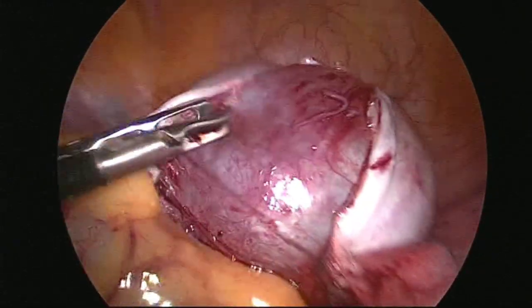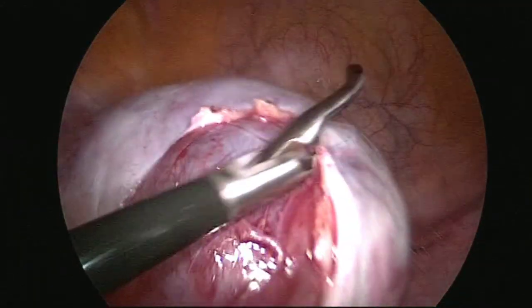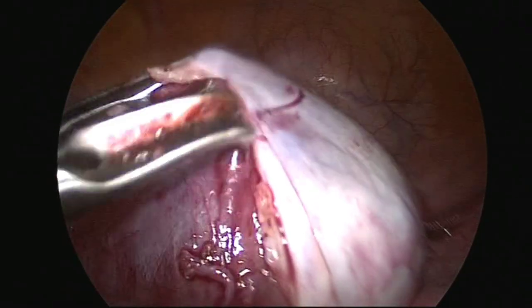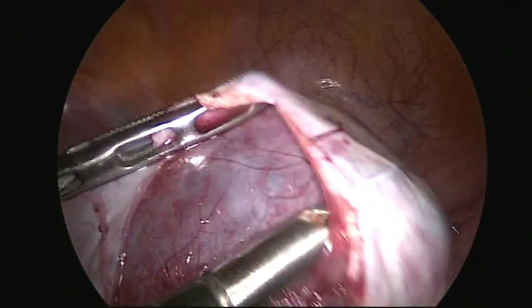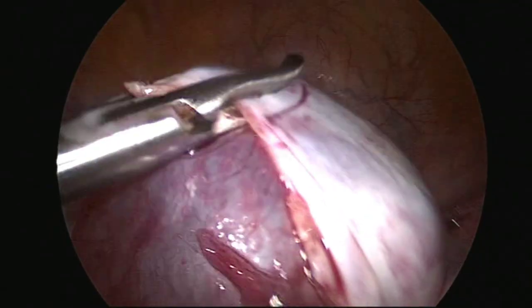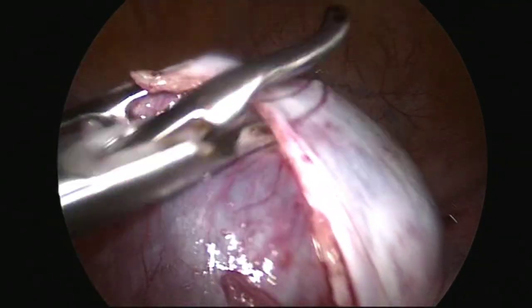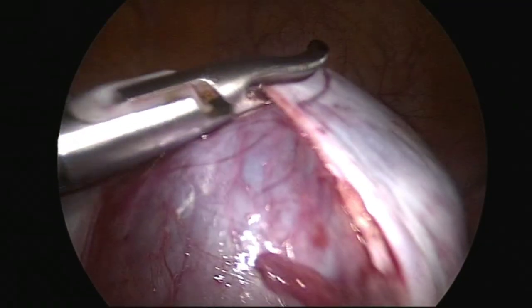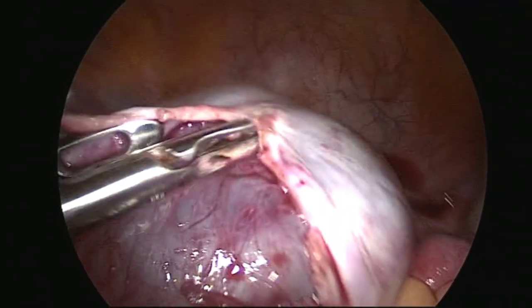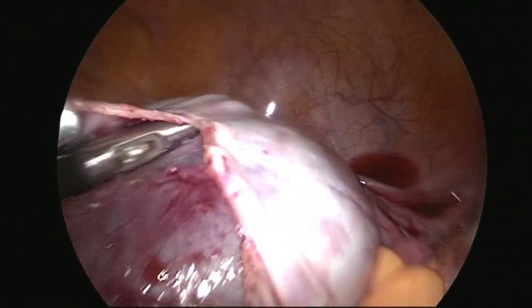Now I just have to use traction and counter traction that will separate the cyst. You can see how easily it's getting separated. Yes, I'm able to separate now.